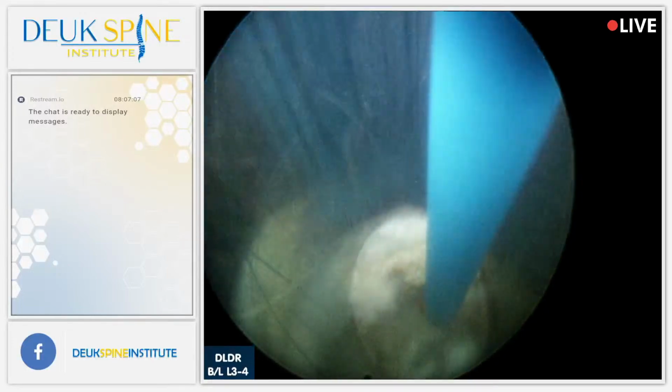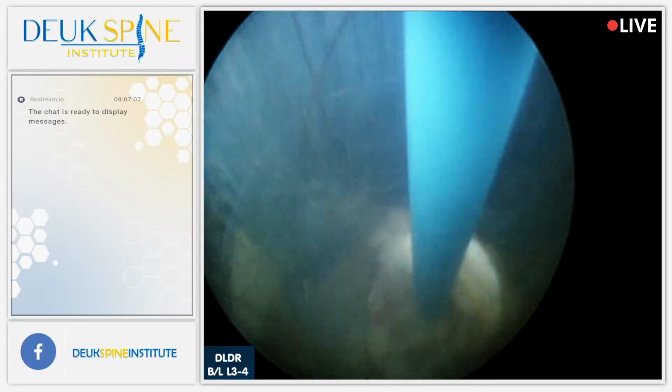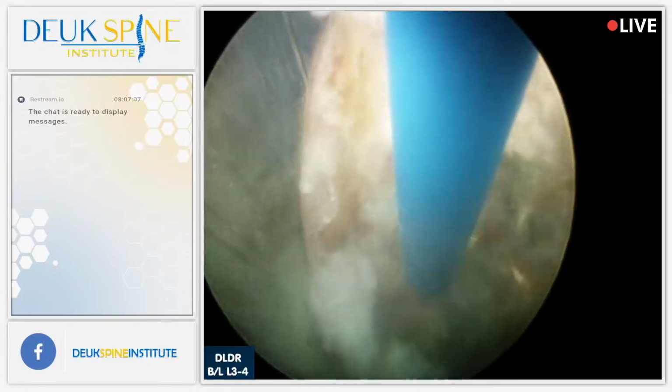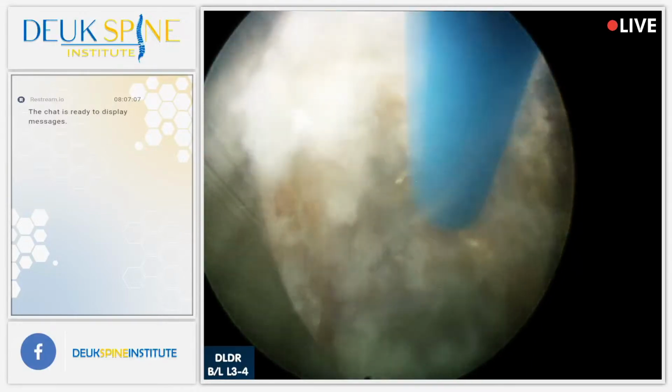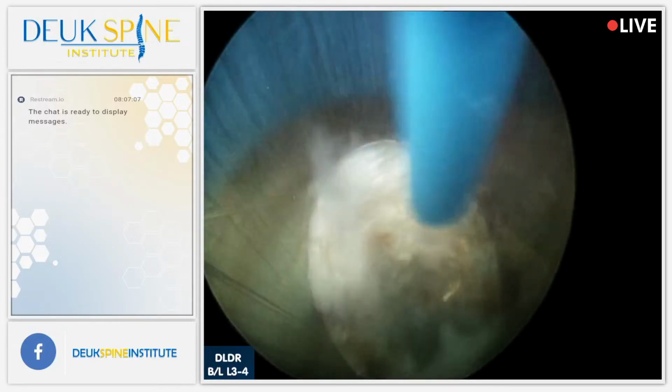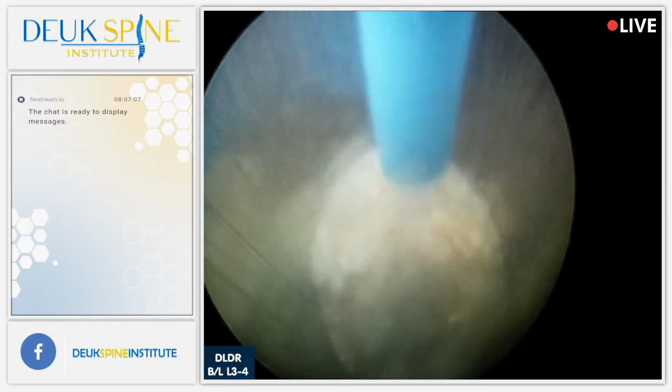And the only thing they're saying is, oh, lasers, you get hot and so it can burn you. They're lying. You can't burn something that's underwater. And not only that, but this is cold water. So we keep everything nice and cool.